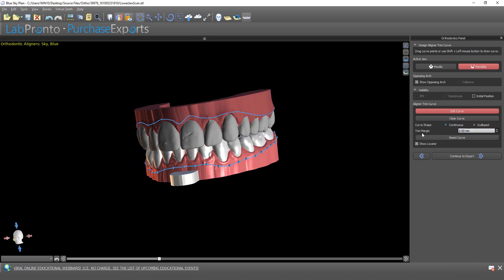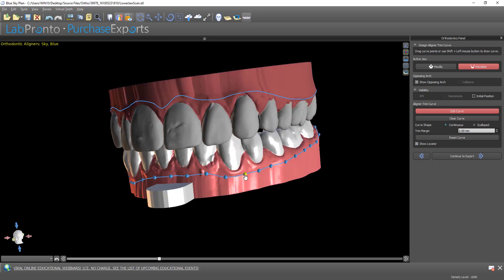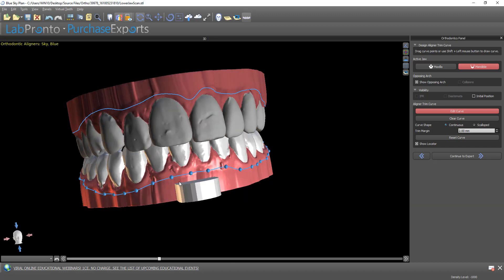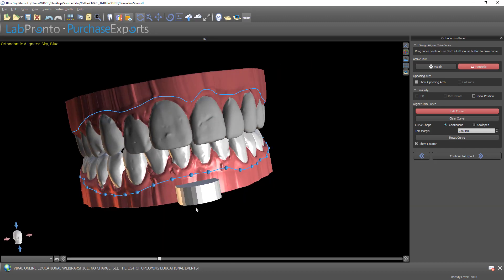We can change any of the settings here — trim margin distance, continuous versus scalloped — and we can toggle the locator on and off. We can also grab any of the nodes if we want to manually update the curve. Any changes made to the current set of models will cascade through all of the relevant models.